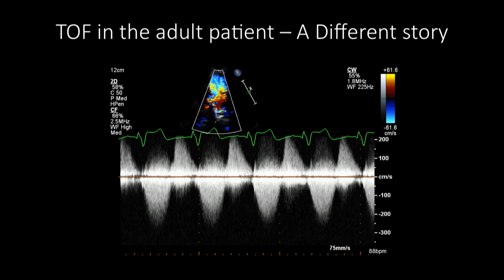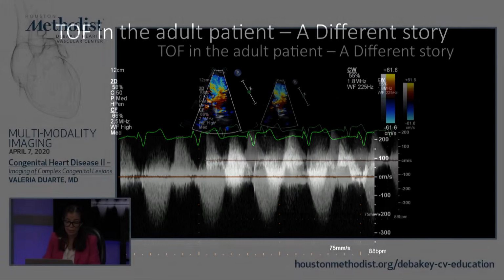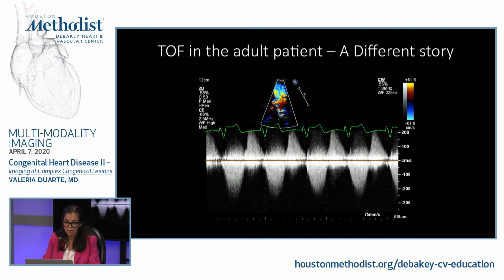So I had suboptimal imaging in a difficult body habitus, but in spite of that, I was able to look at suspect severe PR, go frame by frame and confirm it, and then by adding my Doppler profile, I can be more certain of what I'm looking at. And a lot of these patients may have stents or prosthetic valves or artifact that may limit how much we can assess them with MRI. So a lot of times with echo, we need to make this diagnosis by echocardiogram only.